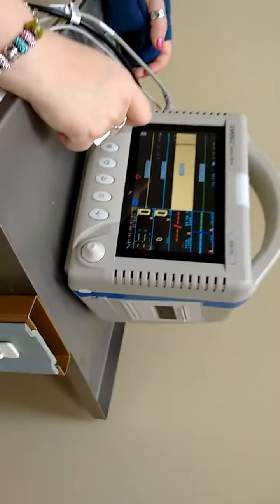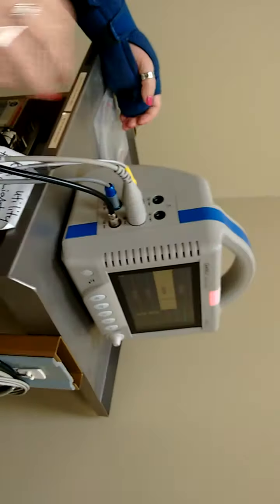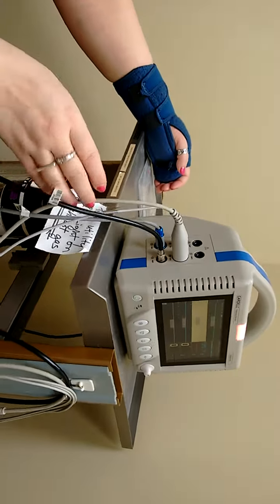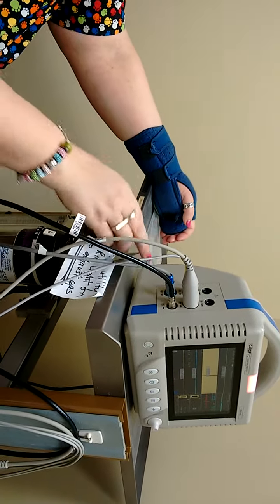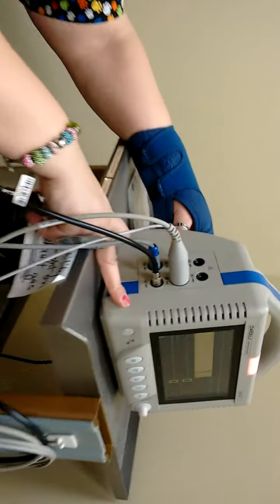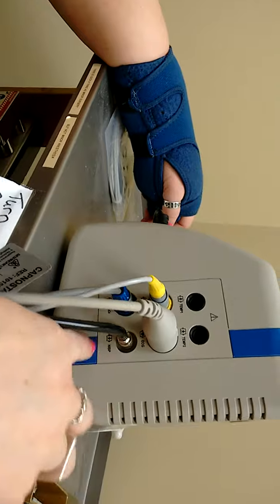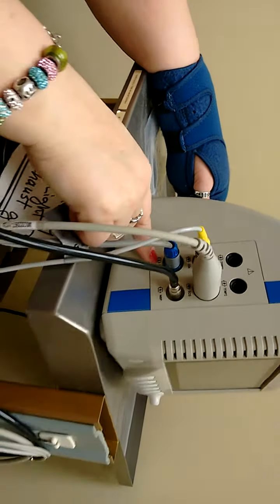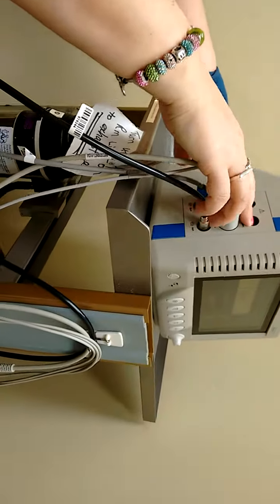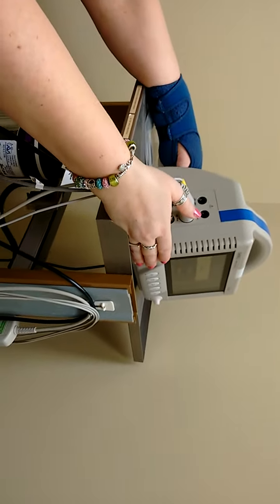And what about the attachments? There are different attachments, and not every machine has all of them. What we have in this one is a basic, I believe, and it's all listed here: the CO2, ECG, blood pressure, and then pulse ox. There are also temperature monitors you can get. Some may not have the ECG.